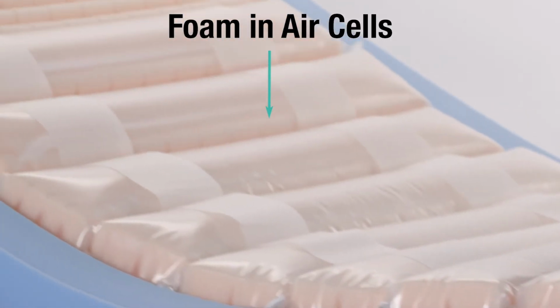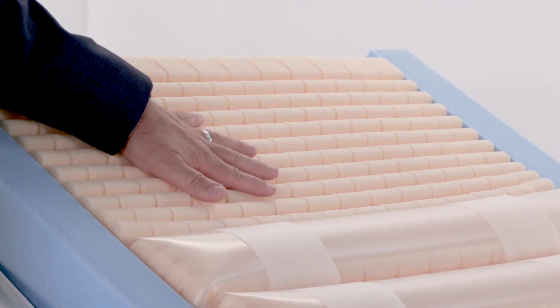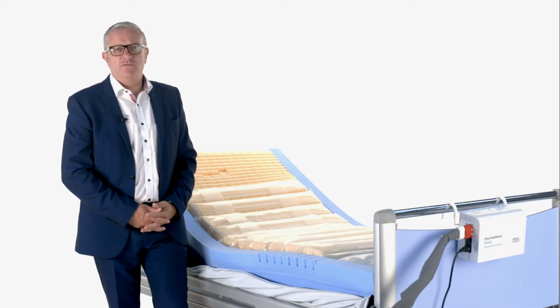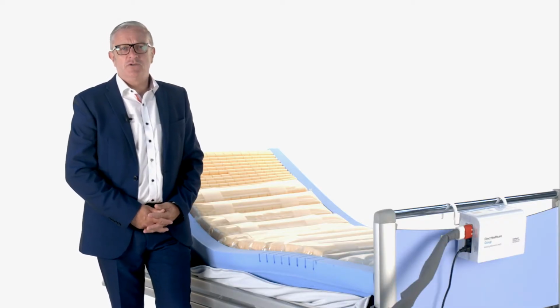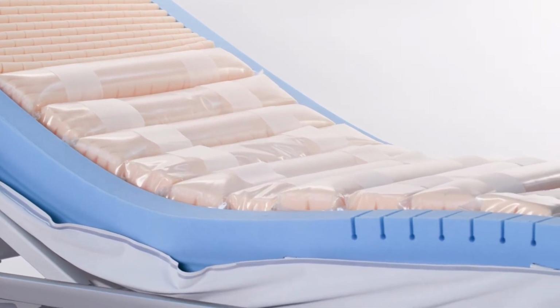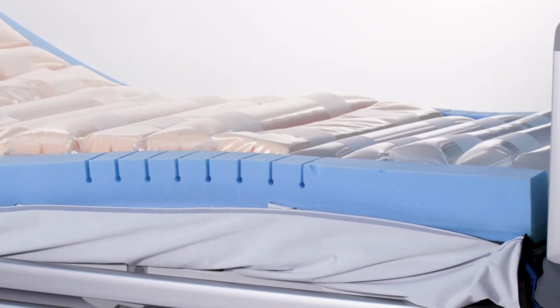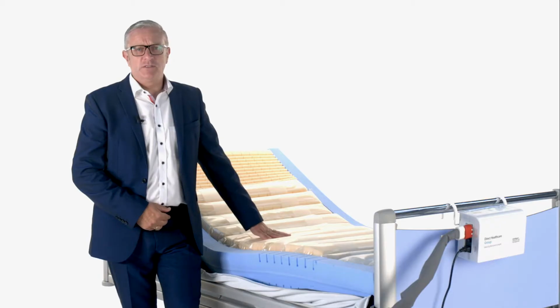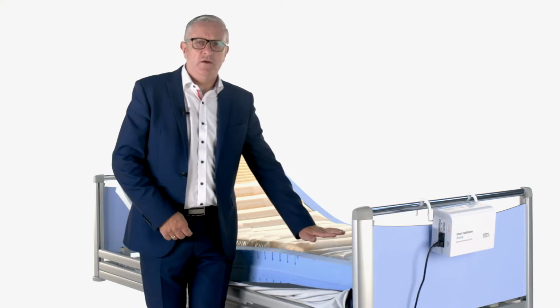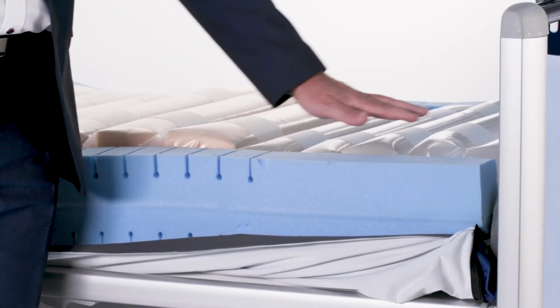At the head end we have a section of castellated foam only and therefore no alternating pressure underneath the head section. This feature stops the patient from feeling nauseous as a result of motion sickness. Moving down, we have 10 foam and air cells from the shoulders to approximately the mid-calf section. Within these cells we have smaller castellations for the shoulder blades and calves and larger castellations for the torso and sacral areas. 5 air-only heel zone cells can be found from approximately the mid-calf to the end of the heels.